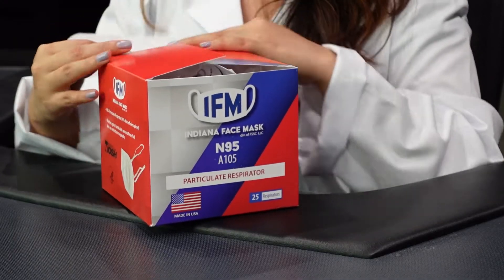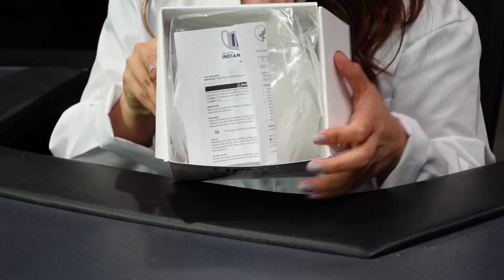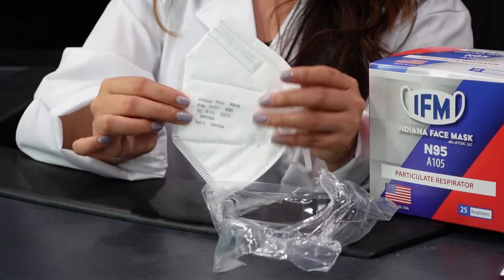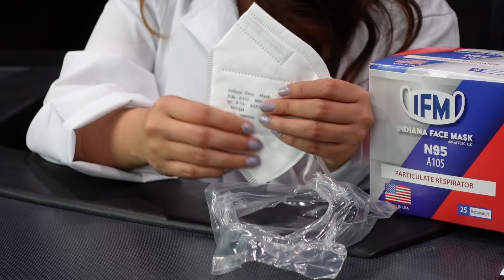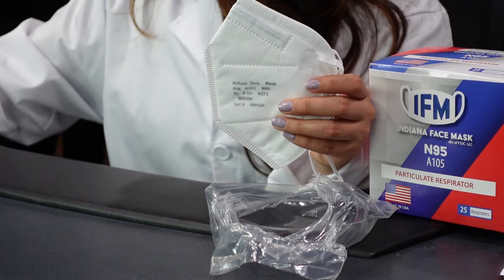Let's go ahead and open the box up. This is how it looks from the inside. At this point we've tested several different respirators from all different manufacturers, and my first impression of these respirators is that they're definitely not as high quality as other face masks that we've tested.